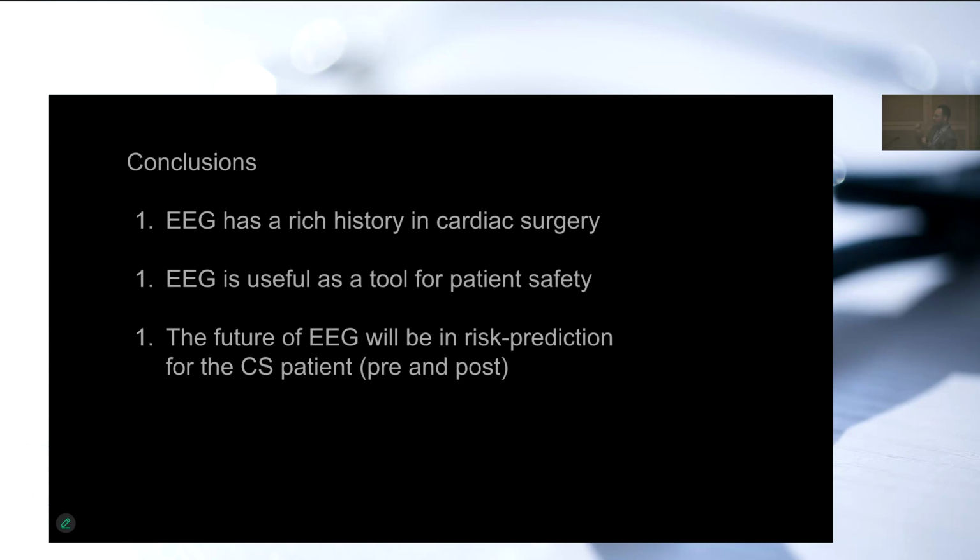If I give you a small amount of midazolam and it makes you sleep, the EEG will look like sleep. It will not look like midazolam. So do you see the problem? If I then tap you on the shoulder enough and you wake up, you'll wake up like normal. But that doesn't mean that the midazolam didn't have an effect. It also doesn't mean that the EEG should look like midazolam.